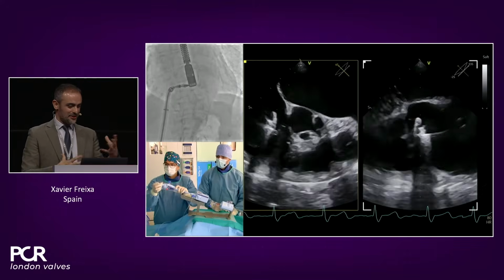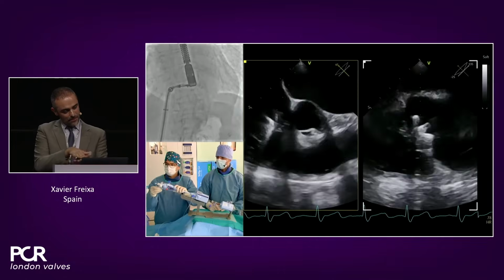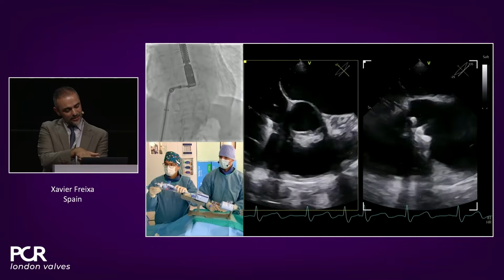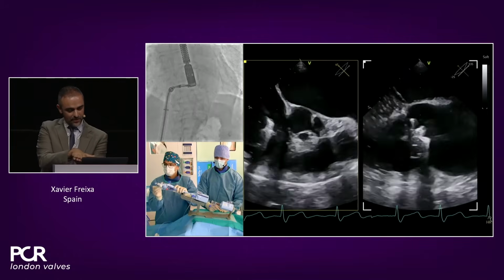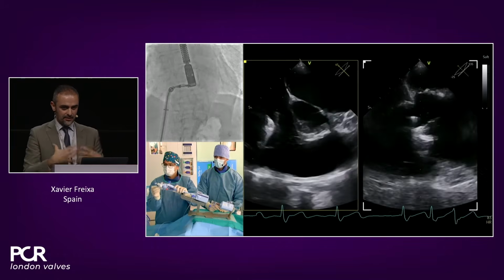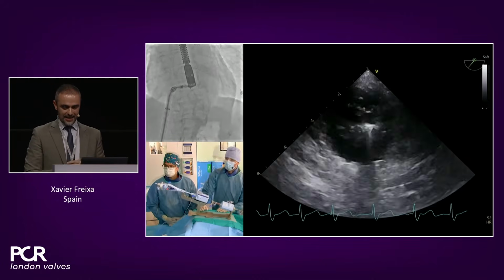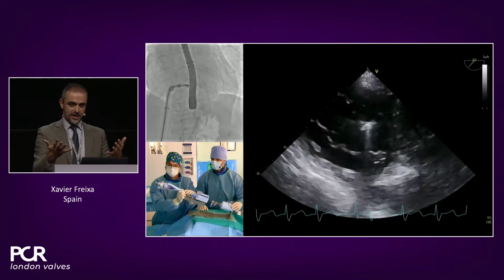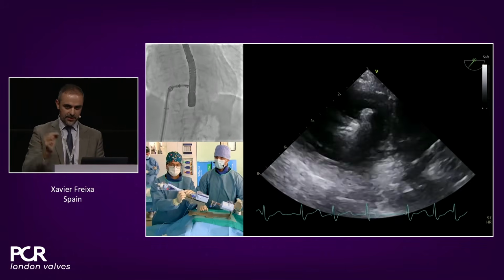Another thing that we use, in terms of fluoroscopy, we try to make the clip completely horizontal and from the side, to see that you see it from the side. So in general, like 90% I would say of the times, when you open it, you can see both arms. Then you check, as you saw, the grippers, the individual line of the grippers, that there is a point.